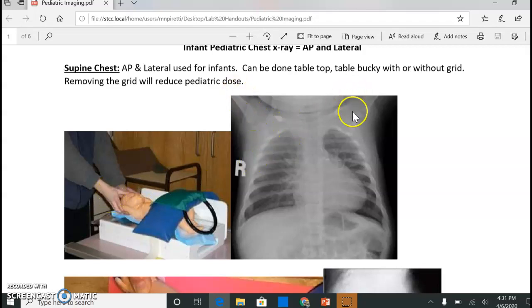For the supine AP, you want the arms up and out of the way. The marker here is really close to the anatomy of the ribcage, so maybe up and out of the way would be better — as flat as possible. Trying to get the image on an inspiration is tough if they're screaming, but actually the end of a scream is usually when they take a deep breath in.